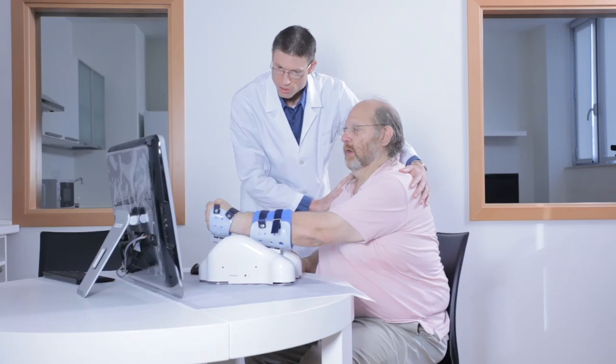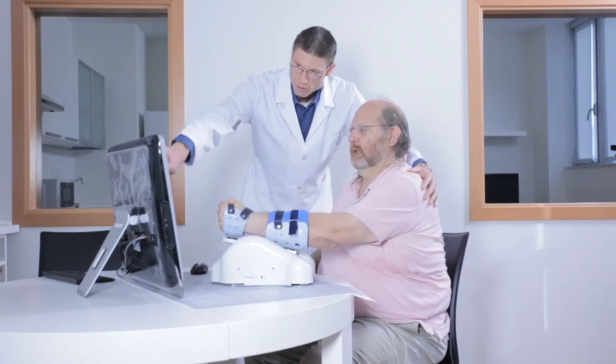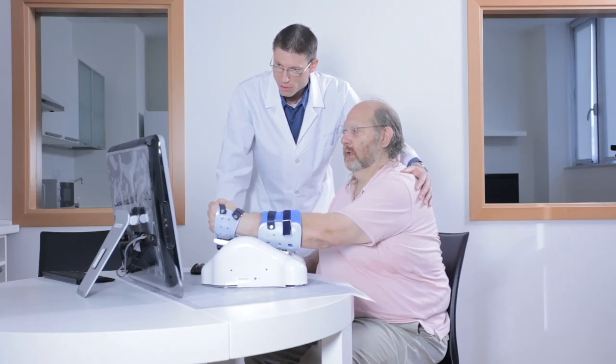The device is attached to the user's forearm by an arm orthosis, and various modules can be used to enable capacities of complex reach and grasp tasks.